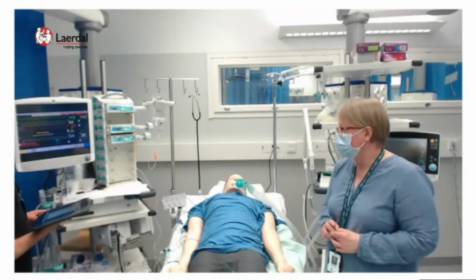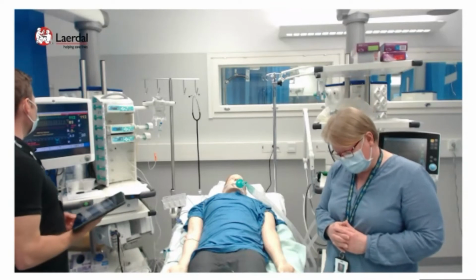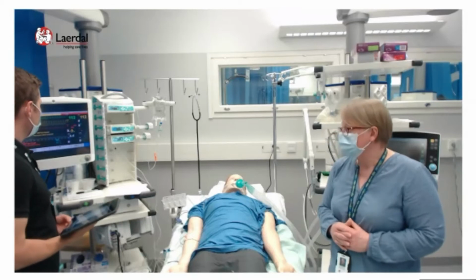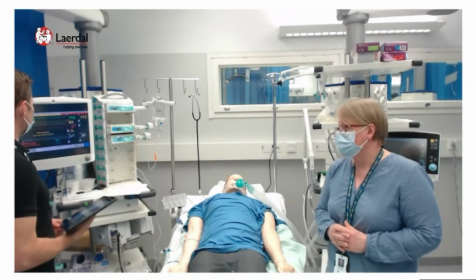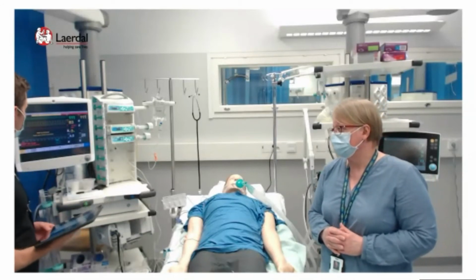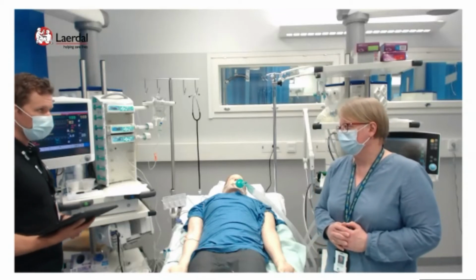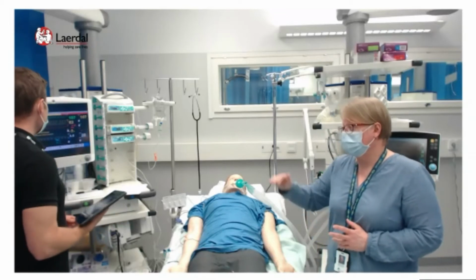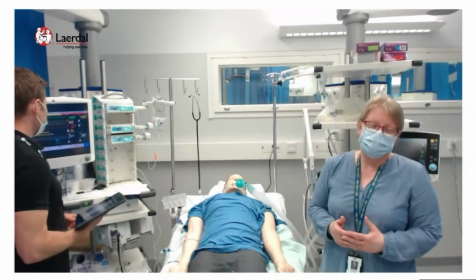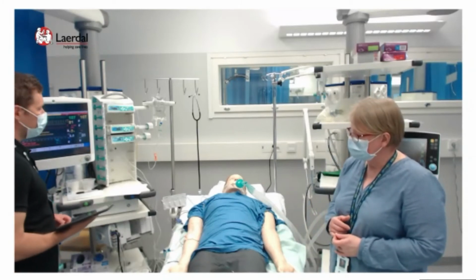ventilator. Yeah, the vitals at the moment are a heart rate 112, saturation roughly 80, 82, 83. Arterial pressure is 90, 92 over 40, 43. And the capnograph is 4.5 at the moment. It might rise a little bit because of the problem of elimination of carbon dioxide. And the respiratory rate is 20.